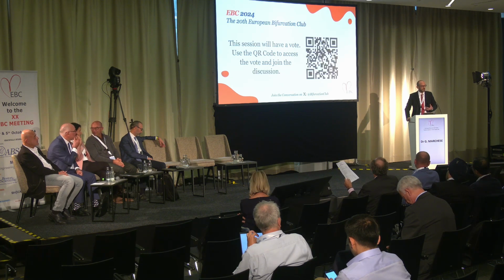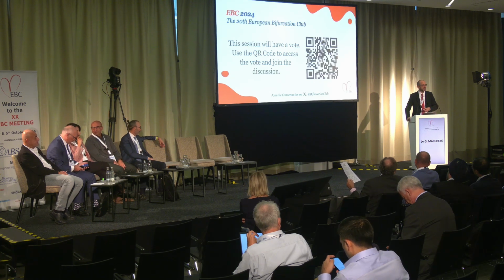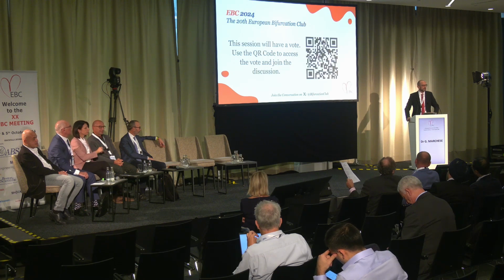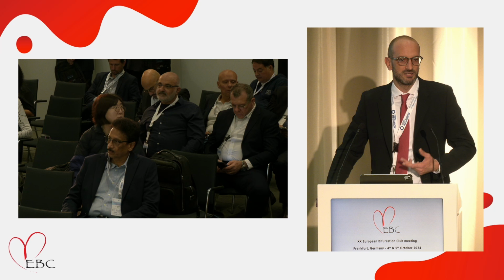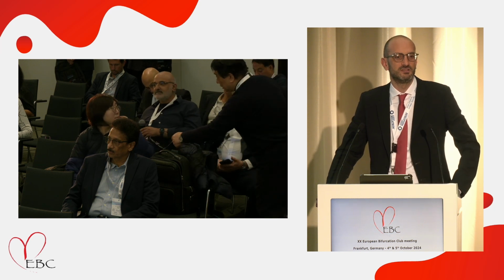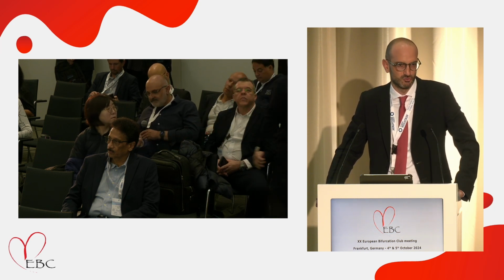So we exchanged the wire, we performed a small injection, and this was done, so we were safely sure that we were in the true lumen distally.